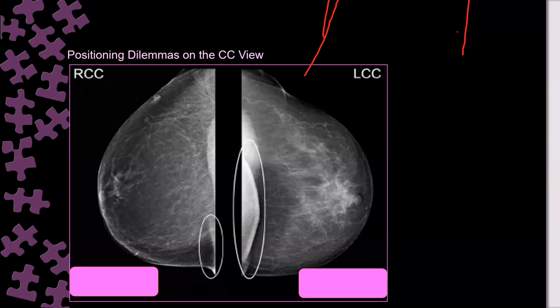What is this? This is pectoralis. And what is this? A skin fold. Yes, there is a fold here, it is a skin fold, same as the mammary fold, you remember? Nawras, answer that case. I think Bell got the skin fold. I missed it. You said that was it.